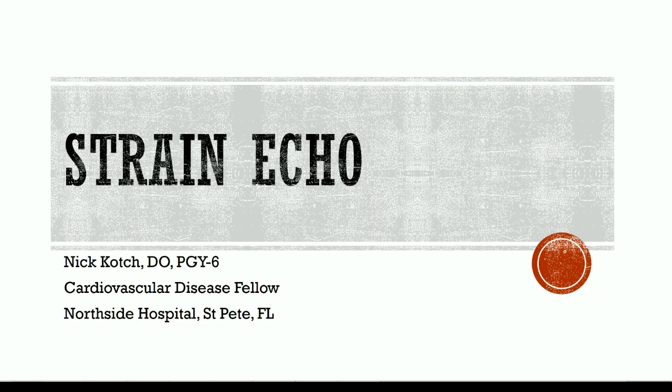Well, we looked at that for a long time, and, you know, you sort of blow past them and say, there's a strain, what is that doing? And after a while, when we found something to validate it with, we became very excited. And we were validating it with CT-MPI, which is CT myocardial perfusion imaging, where we're imaging the iodine in the myocardium and doing something to vasodilate to cause hyperemia.